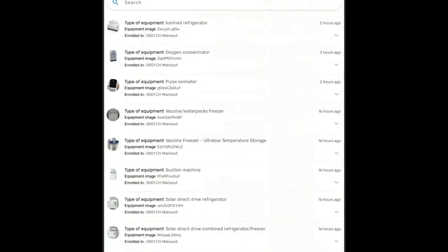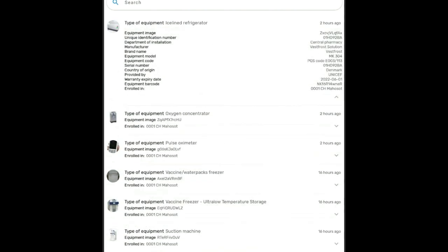And that will open a list of the equipment. So you see you have here a list of all the equipment in a clinic or hospital. If you tap on the expand menu, you have all the equipment details for that piece of equipment.